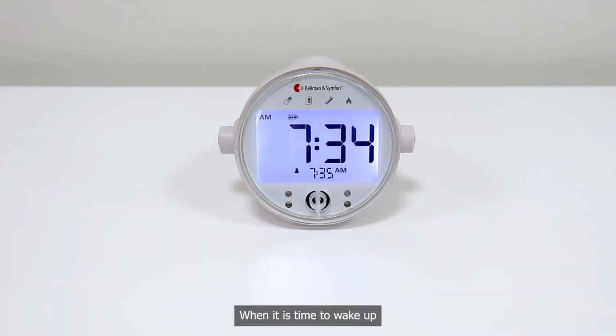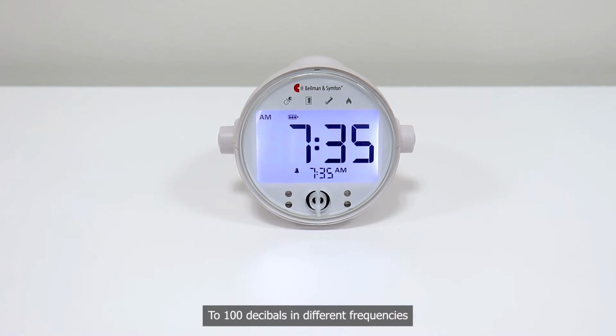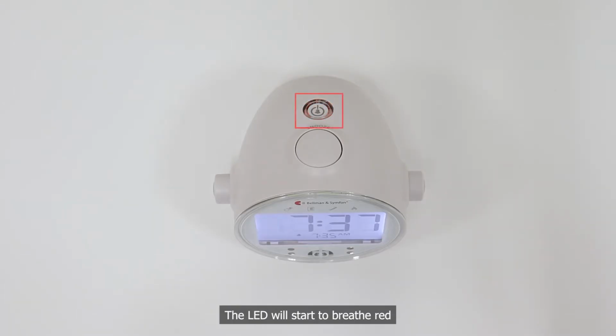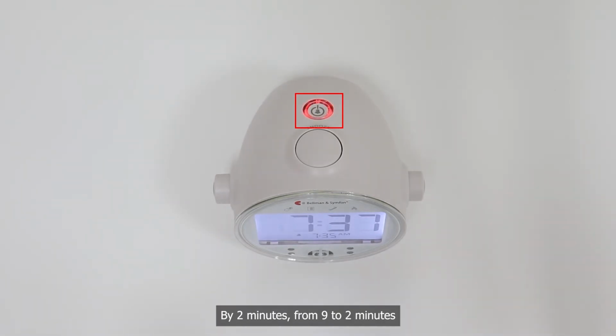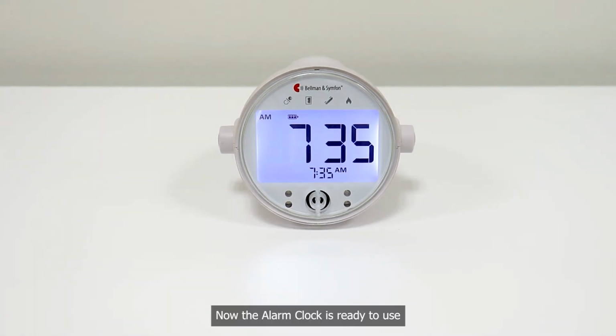When it is time to wake up, the alarm will produce bright flashes, the bed shaker will vibrate, and sound will begin to increase step by step to 100 decibels in different frequencies. To snooze the alarm, press the snooze button here. The LED will start to breathe red. The Smart Snooze function reduces the snooze time intervals by 2 minutes from 9 to 2 minutes. To turn off the alarm, press the alarm on-off button. Now the alarm clock is ready to use. That's how easy it is to set up.